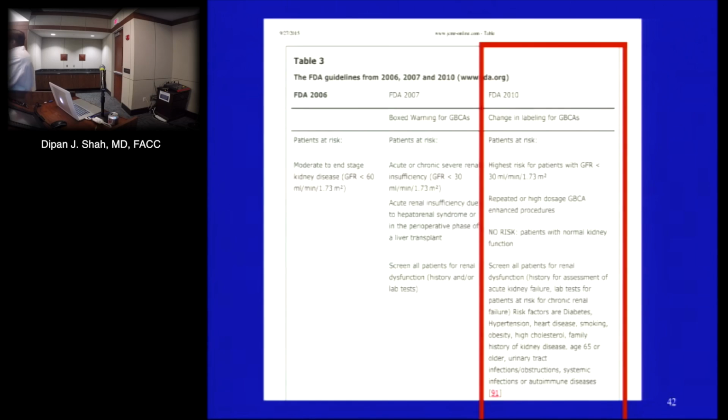Now the problem, if you're doing an orthopedic MRI service, maybe this might apply, where you could find some patients that don't have any of these criteria. Most of our cardiac patients, in fact, do, and that's why what we generally want for most cardiac patients is that we have a creatinine level checked. But it's driven by having these indications, but the reality is most of the patients that we're going to image are going to have these indications.